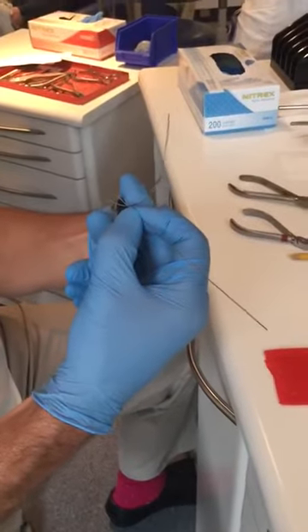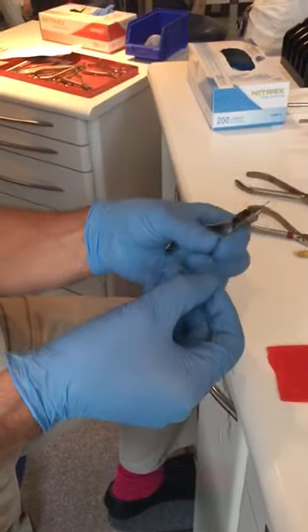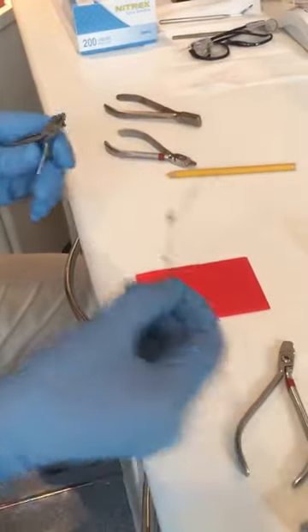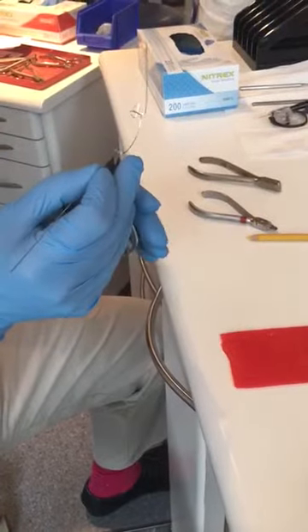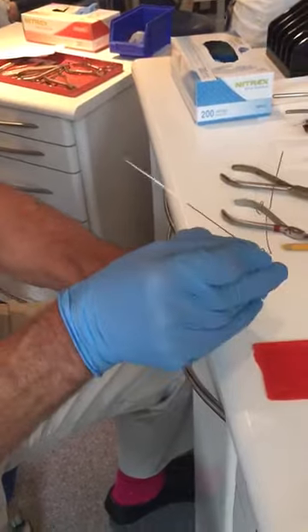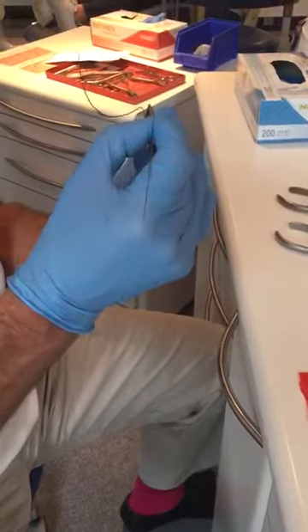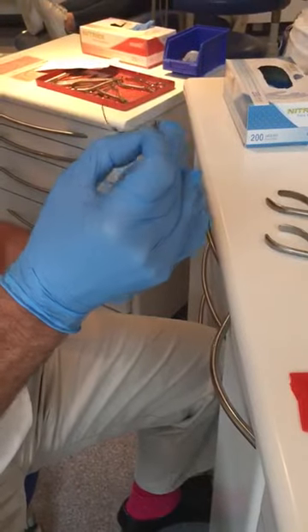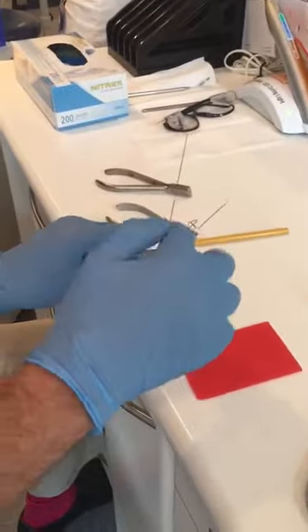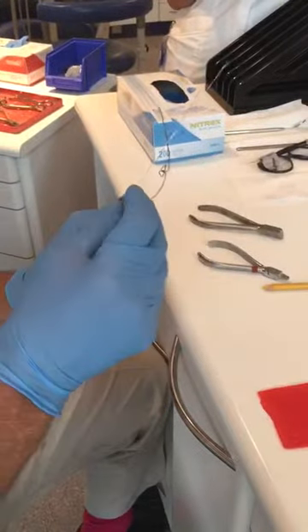And you try not to make it go too high into the buccal sulcus, because that's potentially traumatic. So you try and keep the vertical bits more or less in the same arch form if you can. And that's an art in itself. Okay, and then once again we have to get this wire inside here. So you sort of flip those round like that.